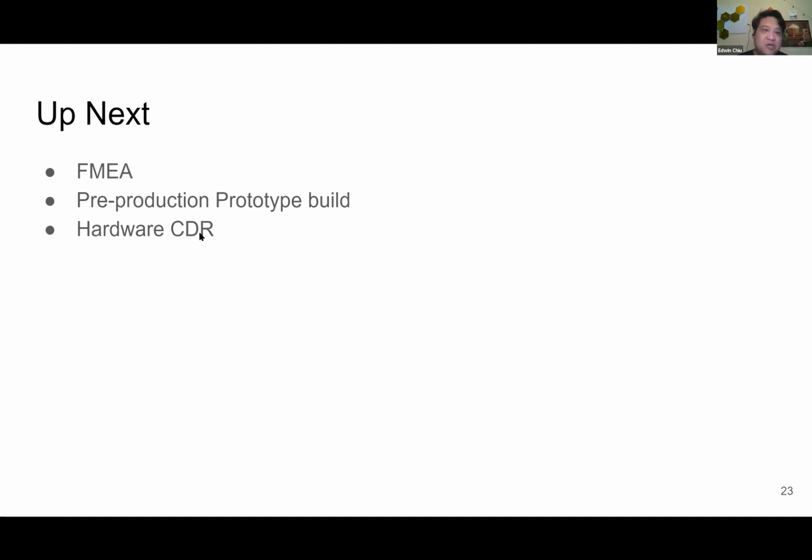So we should do the CDR when we're almost ready for manufacturing. We want to prove to ourselves that we have built the thing that we intended to build and that it's going to work on a patient and be effective.